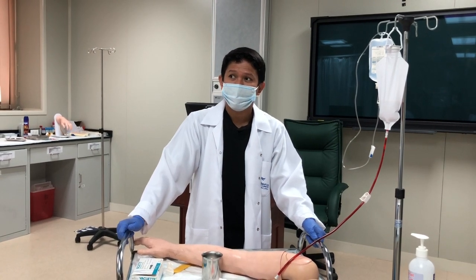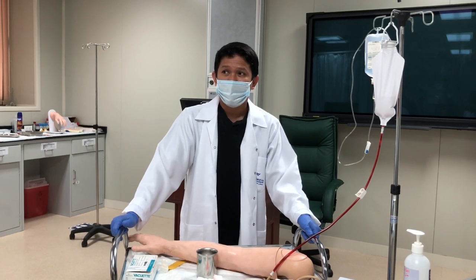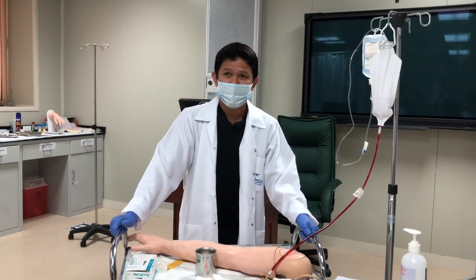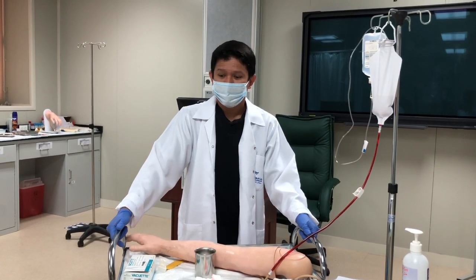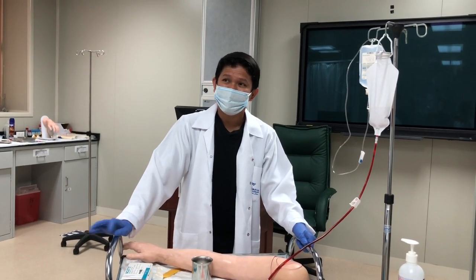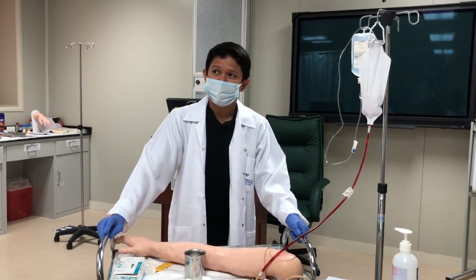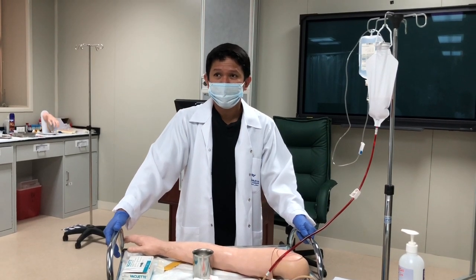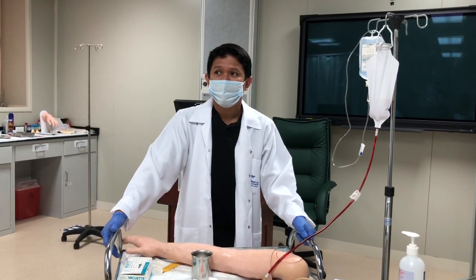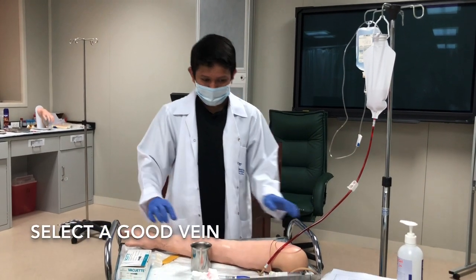Next, you need to introduce yourself to the client. 'Good morning, sir. My name is Mark. I'm your nurse, and I will be inserting an IV so that we can start with IV infusion.' You have to explain it to the patient. There are three identifiers: the name, the birthday, and the MR number. Two out of these three identifiers should be verified by the nurse. 'May I have your name, please, sir? Can I have your birthday, sir?'